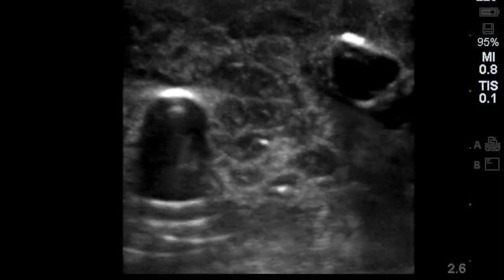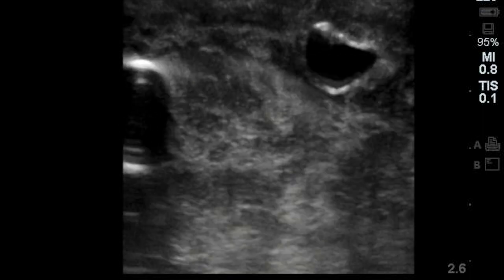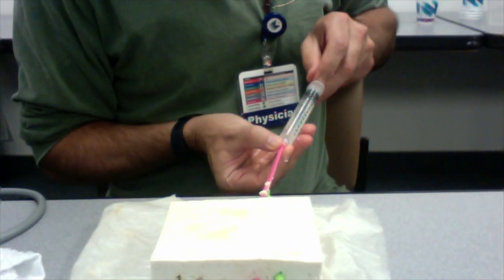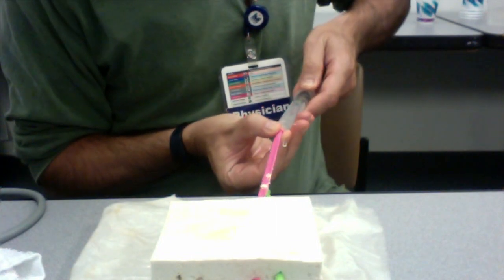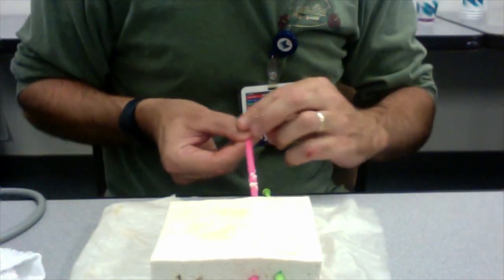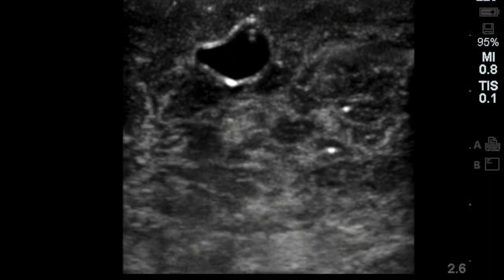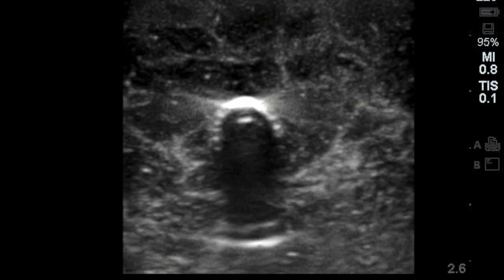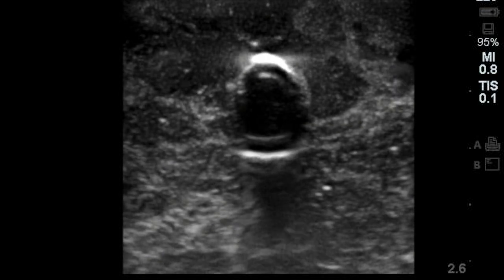Now we're going to create a model for a DVT. On the right side of the screen, you'll see the vein that we created — I made this one low pressure, so it's compressible; you'll see that it's easily compressible. On the left side, you'll see a different vessel, and this one was injected with a solution of Metamucil and put under a little bit higher pressure, so it's more like a vein with a clot in it. There's the low pressure vein, easily compressible with the ultrasound probe — no DVT. Here we're sliding over to the vein with the clot in it; you can see a little echogenic material in there, and it's not really compressible.